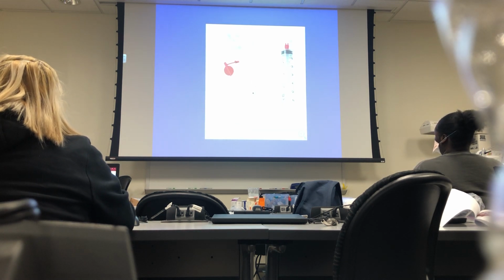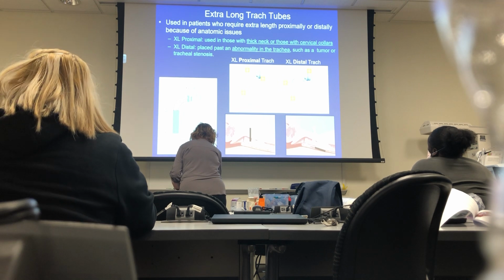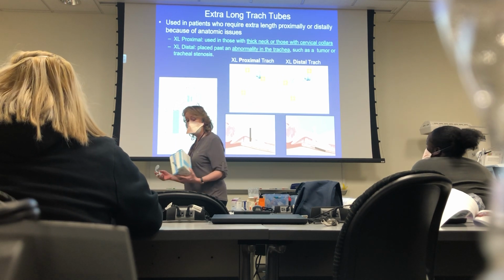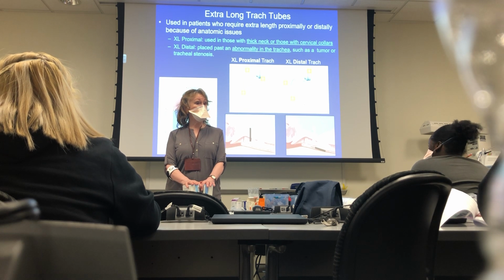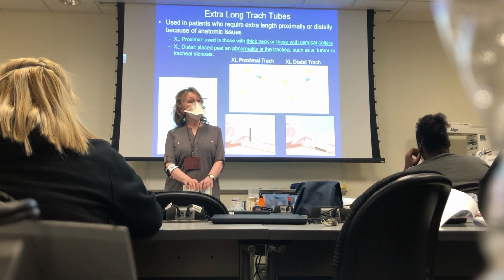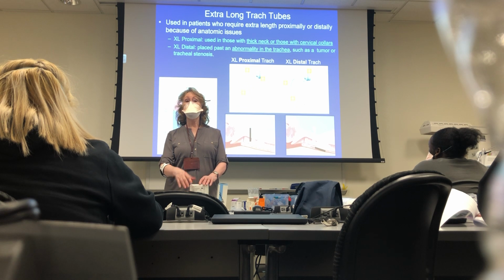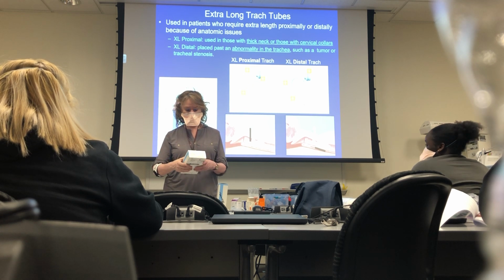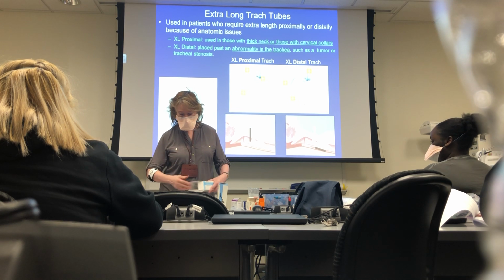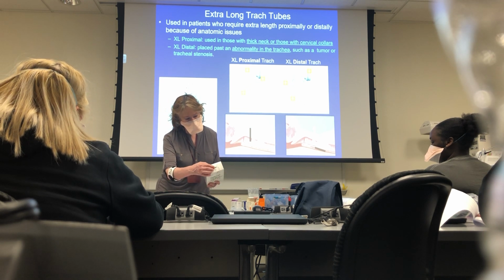Okay, so this is your foam cuff, alright? Now, in the ICUs, we have noticed sometimes with patients that we're ventilating, no matter what we do, we get a leak from the cuff, and people are putting higher and higher pressure in. What they found out is that there are abnormalities that require trachs that are extra long distally or extra long proximally. So if somebody has a very large neck or a bull neck, a lot of adipose tissue, and a regular trach is not sealing, we give them an extra long proximal tube. Hold on. Proximal.